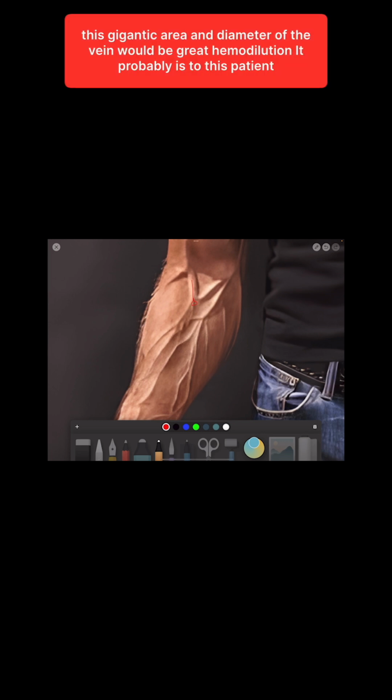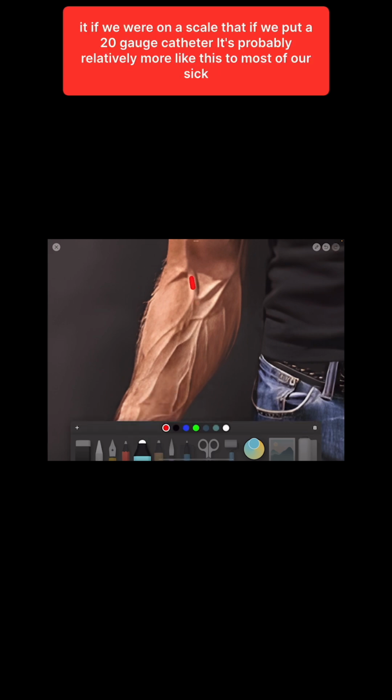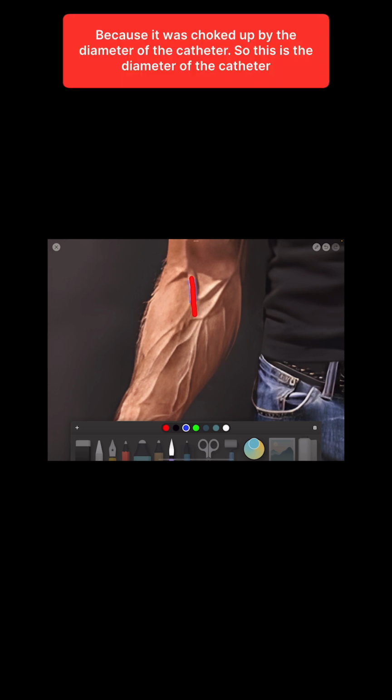You would think that this gigantic area and diameter of the vein would be great hemodilution. It probably is to this patient or to this person. But remember, our patients don't have muscles this big. So, I mean, think about it. If we want to scale that, if we put a 20 gauge catheter, it's probably relatively more like this to most of our sick patients. And then you really don't have a lot of blood flow flowing around that catheter, because it was choked up by the diameter of the catheter.